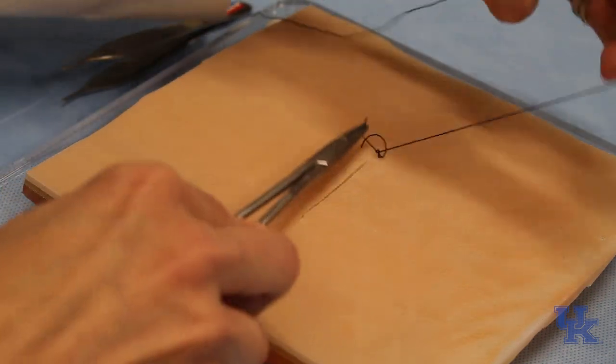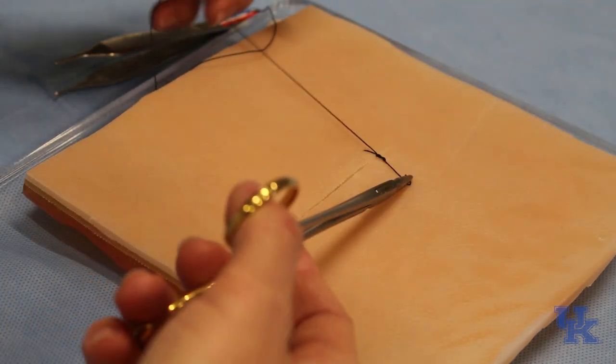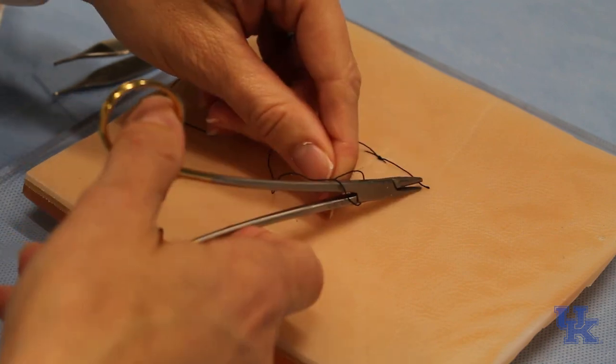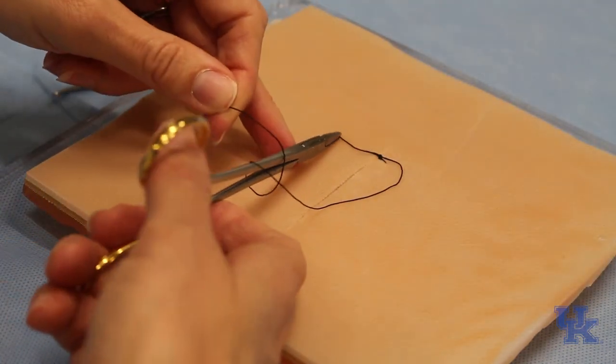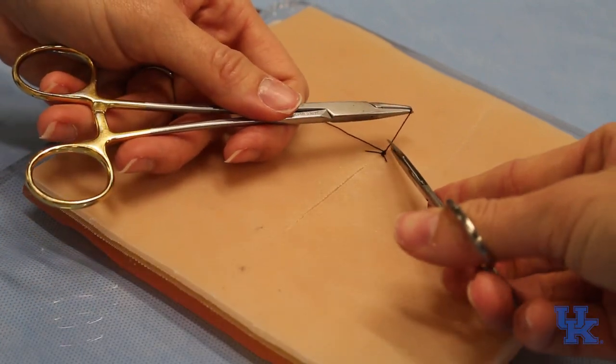The way that we do this differently than the simple interrupted is that instead of cutting both ends of the suture off right here, we're just going to cut off the end without the needle and do one extra throw on.